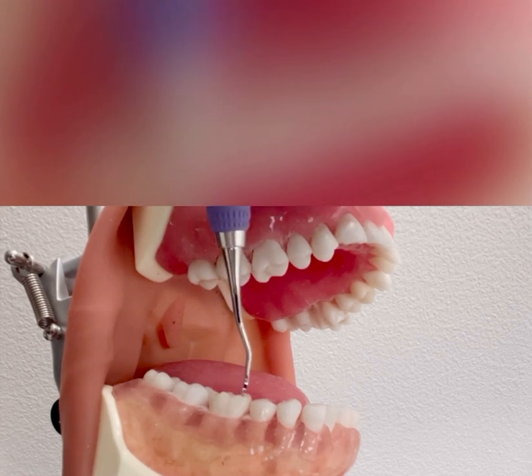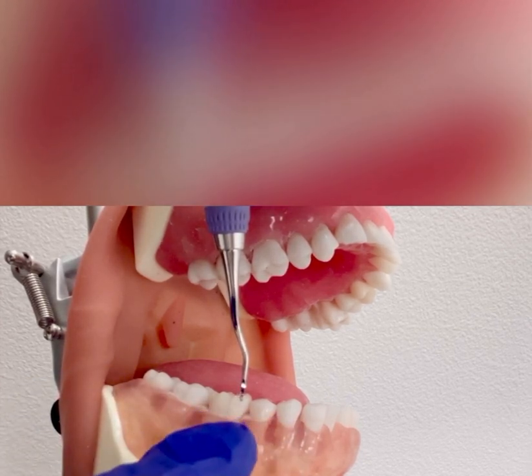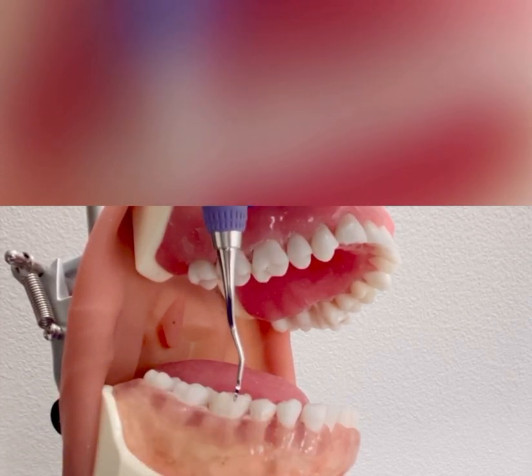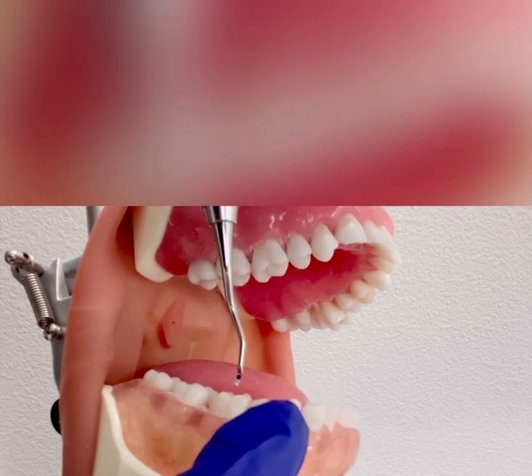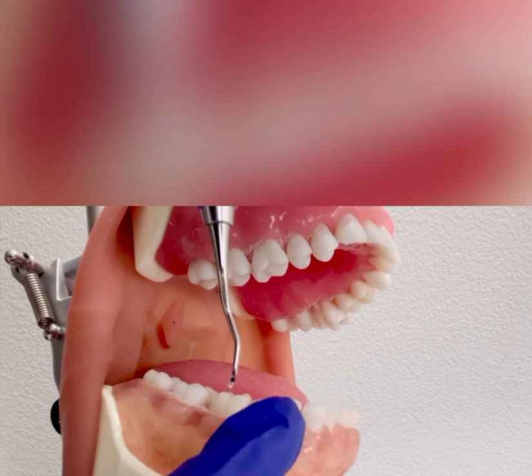To find the correct working end, hold the instrument so that the face is parallel to the ground and the toe is pointing towards you. If you look closely, you can see that one cutting edge is slanting towards the ground, which is already set at 70 degrees and is the correct working end.